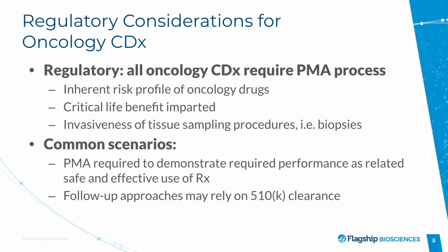They are imparting critical life benefit to the patients, and the process of collection of the tissues necessary for laboratory developed test and later on companion diagnostic are medically invasive procedures like biopsies. Since the regulation of the companion diagnostics is risk-based, automatically this puts oncology tissue-based companion diagnostics into so-called category 3 of risk, which is considered high risk. And a common scenario is that a pre-market application is required and a process of clinical trials to demonstrate required performance as related to the safe and effective use of the therapeutic product.